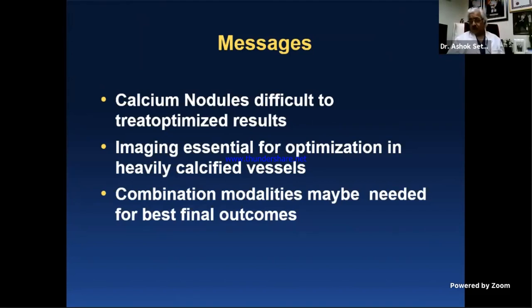Yeah, not the Turnpike spiral, but the Tornus. In these sort of angulated heavy calcification, I tried it in this. It just would not even budge. Yes, that was also tried in this. I didn't show it. It was a 5-hour long case, and that's why I showed what was really relevant, but that wouldn't get anywhere. It just wouldn't even budge half a millimeter into it.